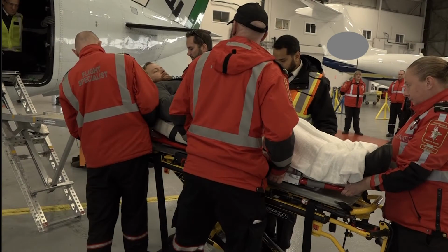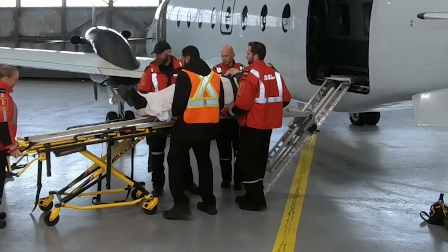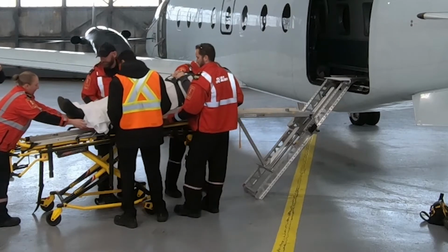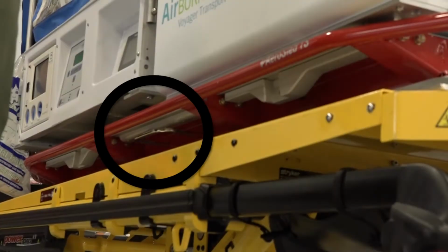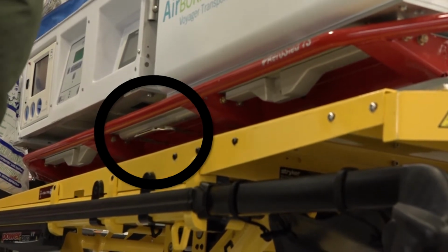6. 5 staff will position themselves around the stretcher. All individuals will be positioned with a wide stance while ensuring that their spine is properly aligned, with the abdominal muscles contracted to support the spine. 7. The person stabilizing the stretcher will be the designated in-charge person and will verbally coordinate all movements through loud and clear communication.